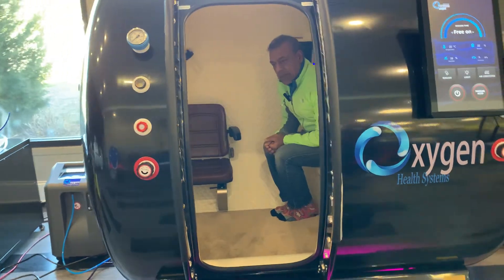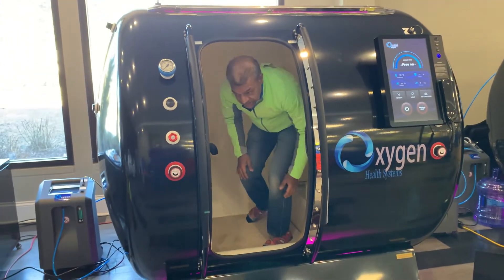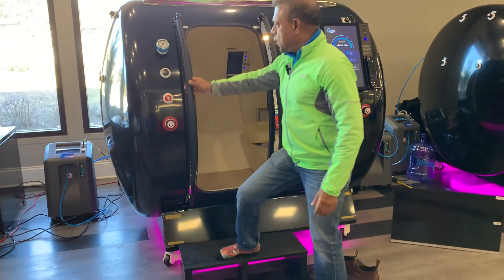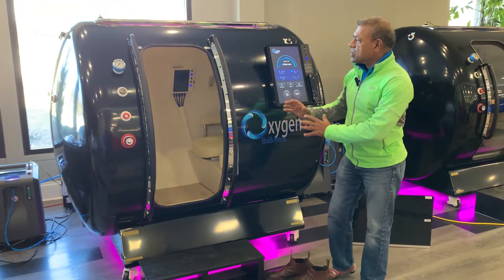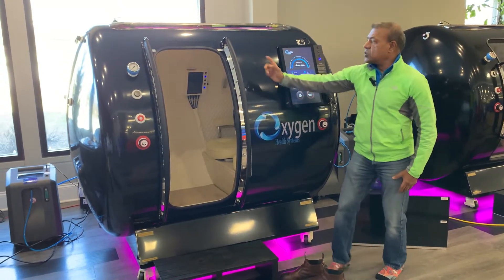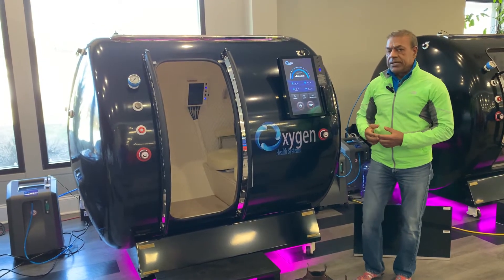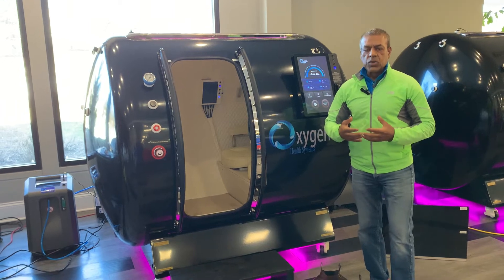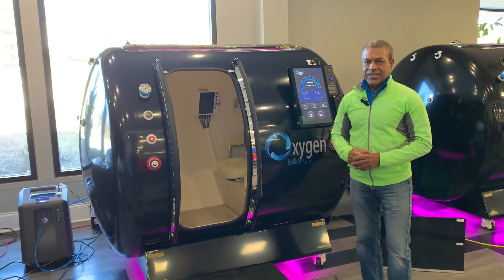The entry and exit is quite simple. Upon session completion, all you would do is just step out, grabbing the handle, and like so, you are out. Easy entry and egress is one of the key features of this type of chamber. With the long curvature, you also reduce the possibility of claustrophobia. With these exciting features, we'd like you to come take a look at this chamber. If you want to see a virtual demo, get in touch with us and we'll give you a live demo. Thank you and have a great day.